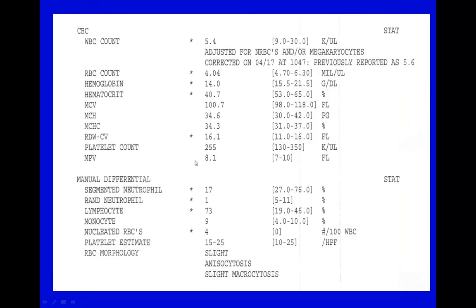Sorry to make you dizzy on your screen. Let's do this one. Here was a patient who had an elevated lymphocyte count. This means 73% of their 5,400 cells are lymphocytes. When this goes up, another value has to drop. And the ones that get impacted primarily are these two that are present in the highest numbers.